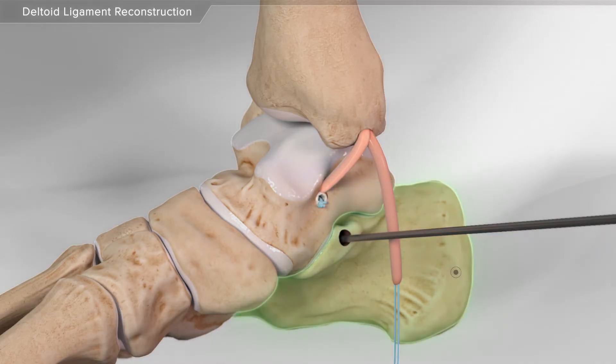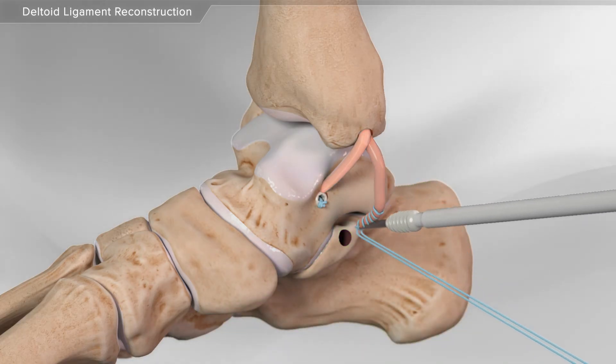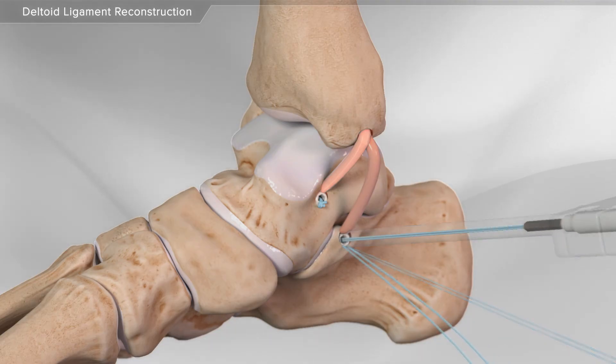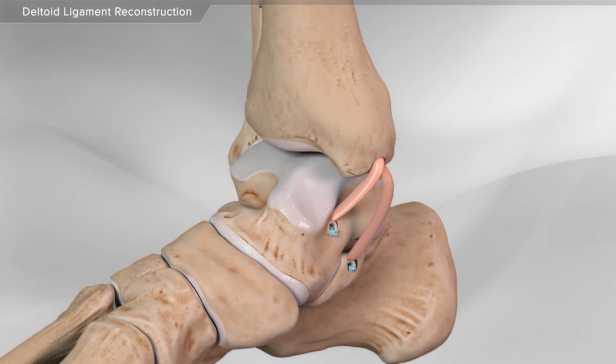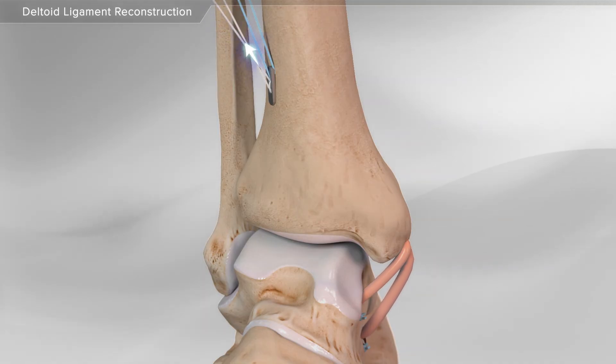Next, your surgeon makes a tunnel in the calcaneus bone. The second end of the donor graft is placed through a swivel lock anchor and secured into place. Finally, the tails of the tightrope implant are tightened until the appropriate amount of tension is achieved, completing the deltoid ligament reconstruction.